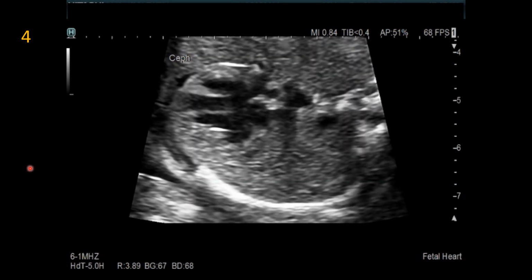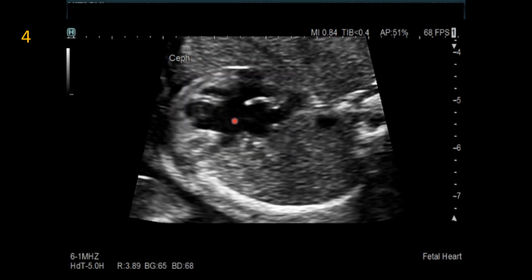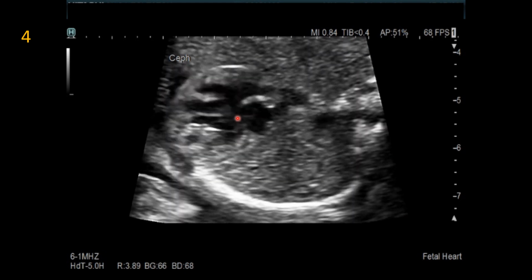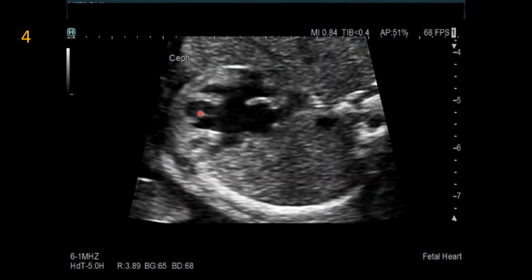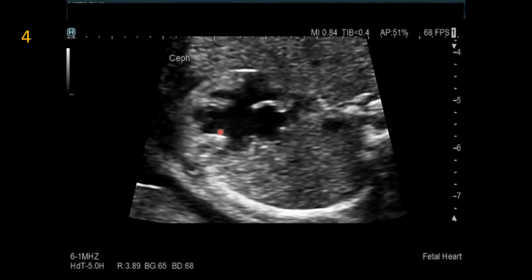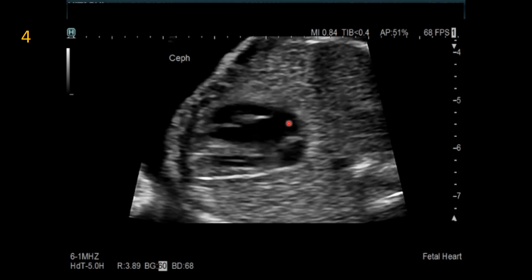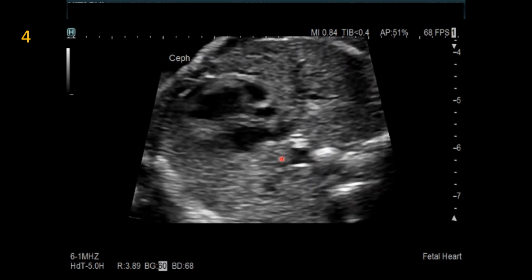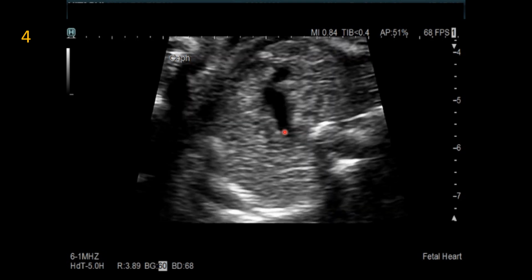And focusing in closer on the heart here and sharpening the image, we can see a complete AV canal defect here with large ventricular and atrial components. The anterior ventricle is the morphologic right ventricle, posterior is the left ventricle, and so de-looping of the ventricles. But importantly, here during this sweep, we can see that the pulmonary veins do not drain to the atrium here.